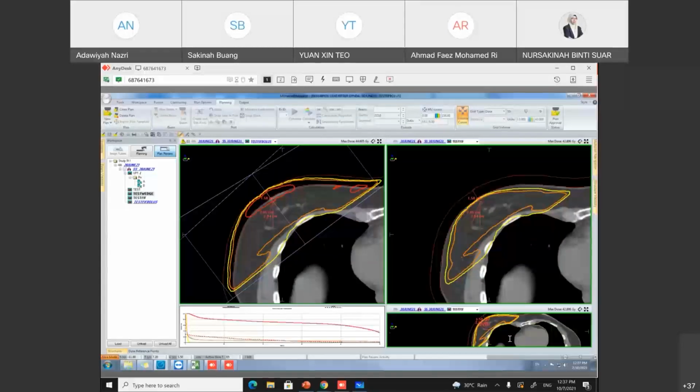Displaying contour line. I don't understand that as well. Okay, no questions.